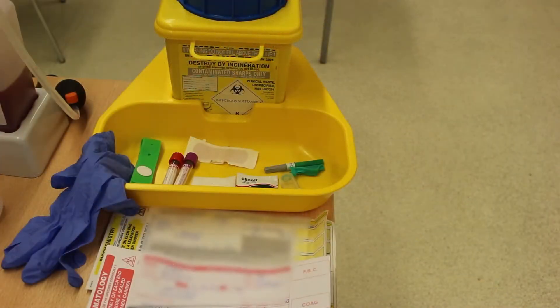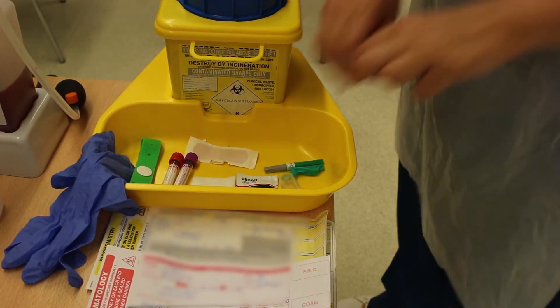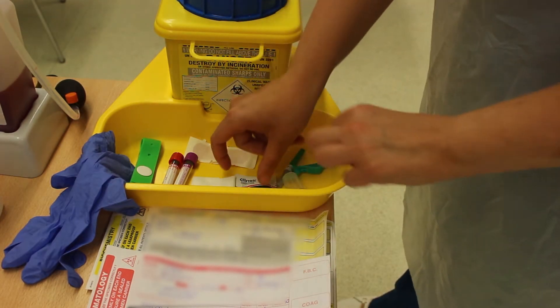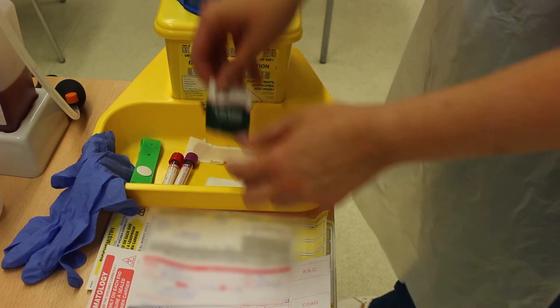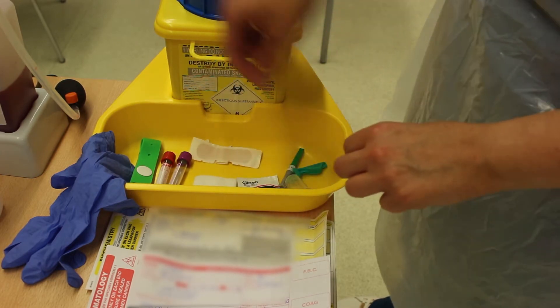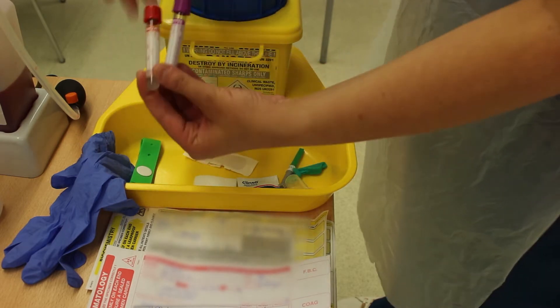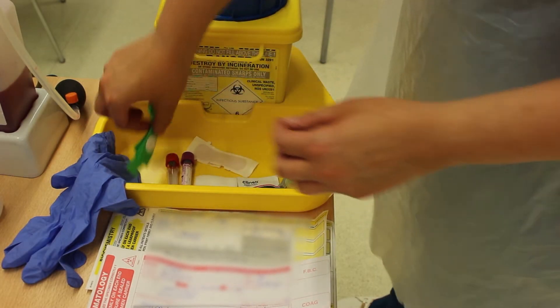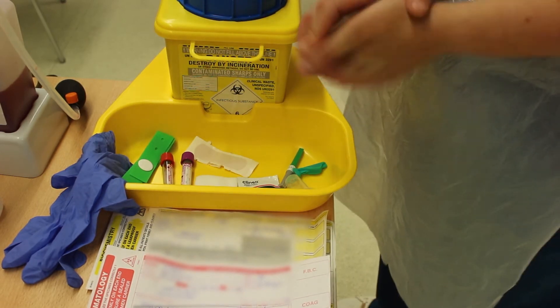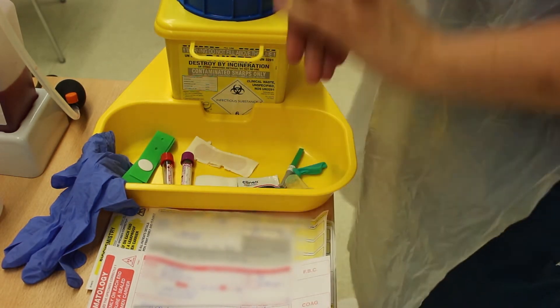This is the equipment I have gathered: a blood collection device — a needle and vacutainer — an alcohol wipe, gauze swabs to clean the site after, a band-aid, blood bottles for collection, a tourniquet, gloves, and my blood request forms.